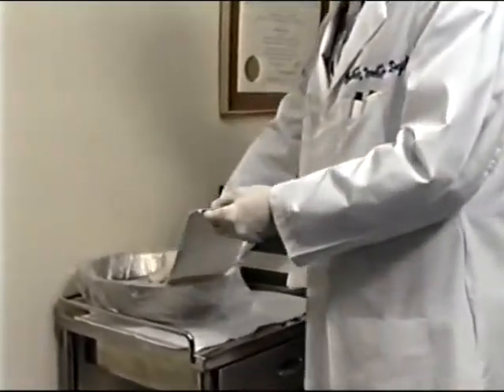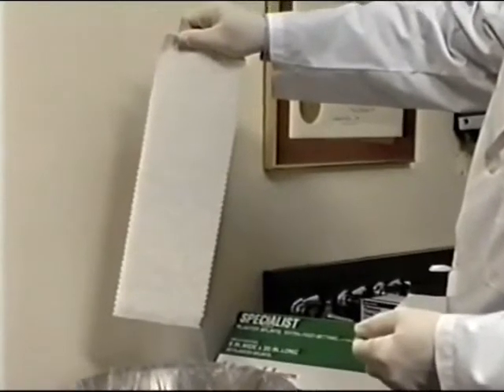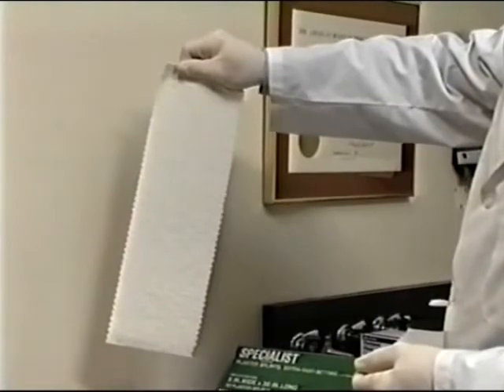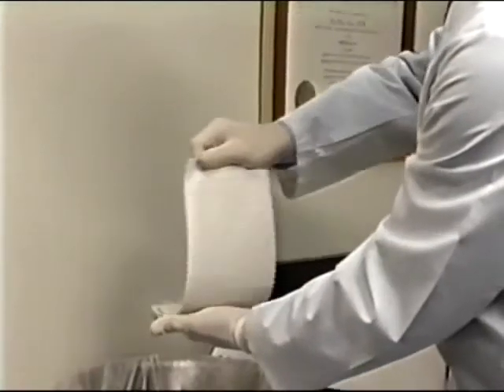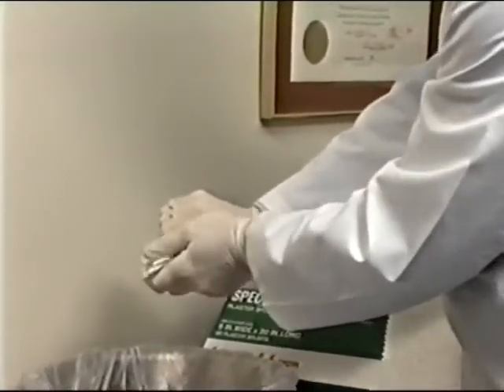The two-splint technique will be used in the application of the negative cast. You begin by passing one folded strip of the plaster through cold water and, while holding the gauze above the bucket, allow the excess water to drip off. After the excess water has dripped away, fold the plaster into your hand and squeeze slightly to mix the plaster through the gauze.